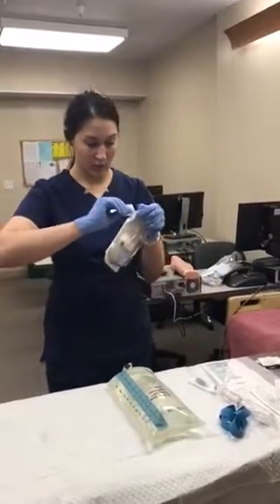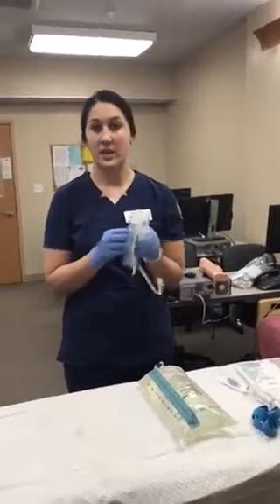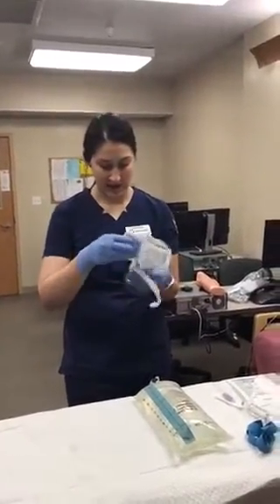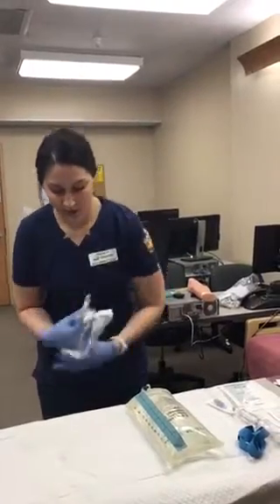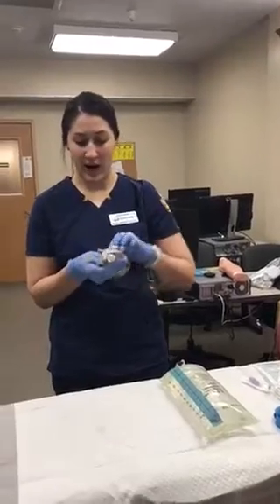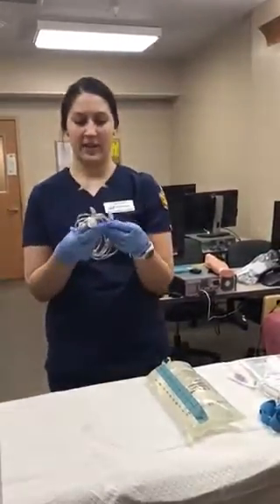I'm going to go ahead and open that. So again, with this bag, you want to make sure that it's not ripped or anything like that, that the bag hasn't become contaminated by any means. When you take out your tubing, you want to make sure to look for any cracking in your tubing, any discoloration in your tubing, if anything doesn't seem right.